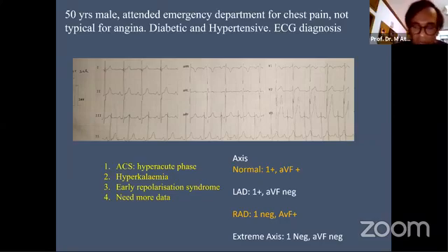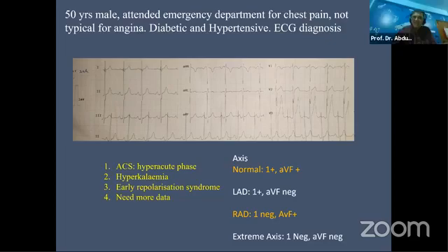What was the paper about finally? I was giving you the clue. It was related to the previous lecture. Always remember, make a habit of it. Whenever you are looking at the ECG, look at the name, look at the date, look at the standardization. It will take only a split second if you make it a habit, and you will be free from many embarrassing moments if you pay attention to this.